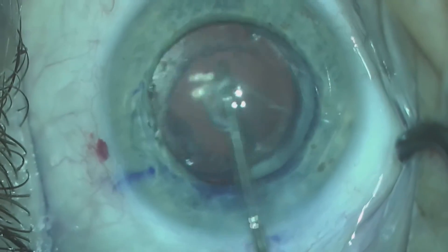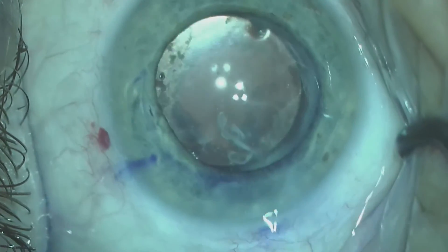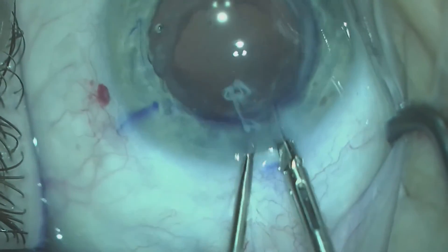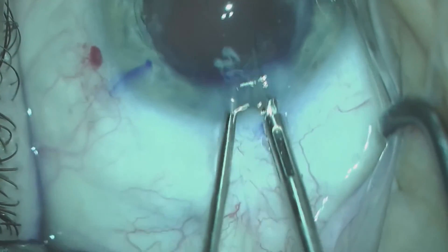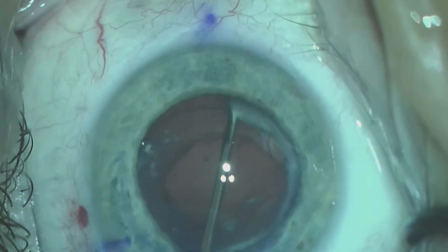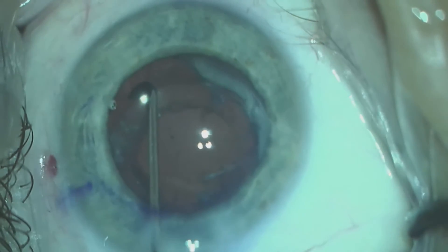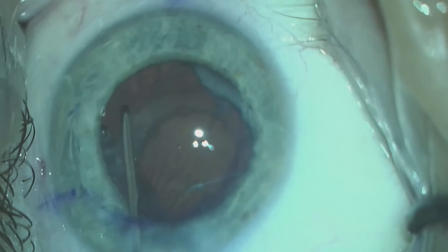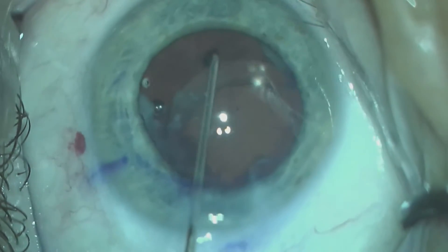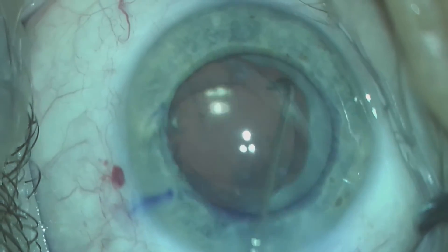You can see there is zonular laxity basically 360 degrees with this lens. At this point, I am using MST micro scissors to cut the last portion of the lens epithelial cells. Once again, we are back in the eye with a chain cannula on our viscoelastic, which is injected around the lens. You can see I am now able to move the lens without moving the bag significantly.